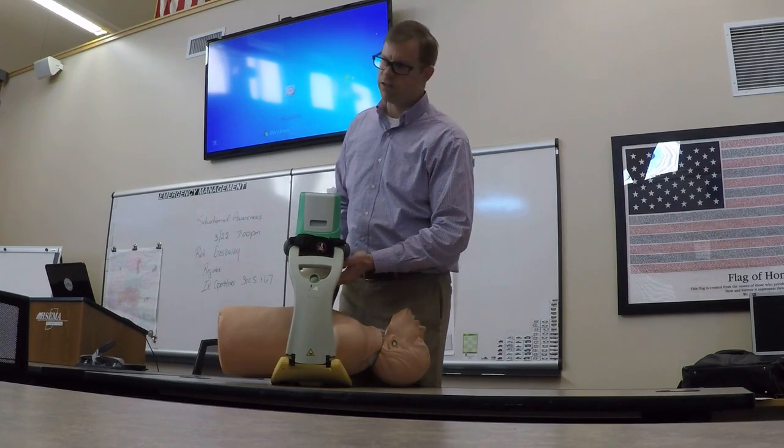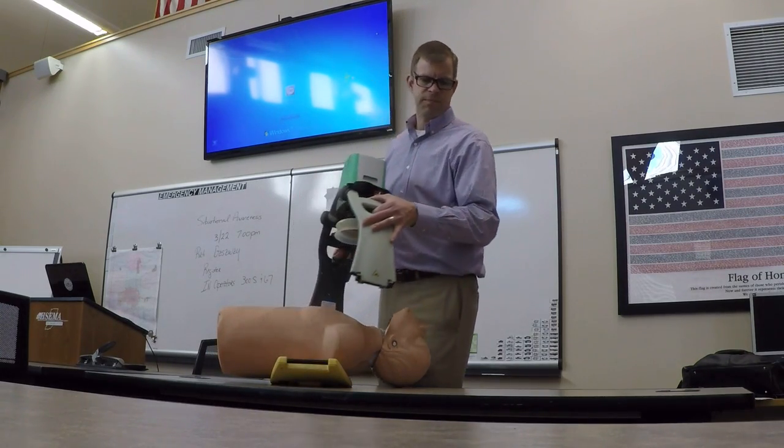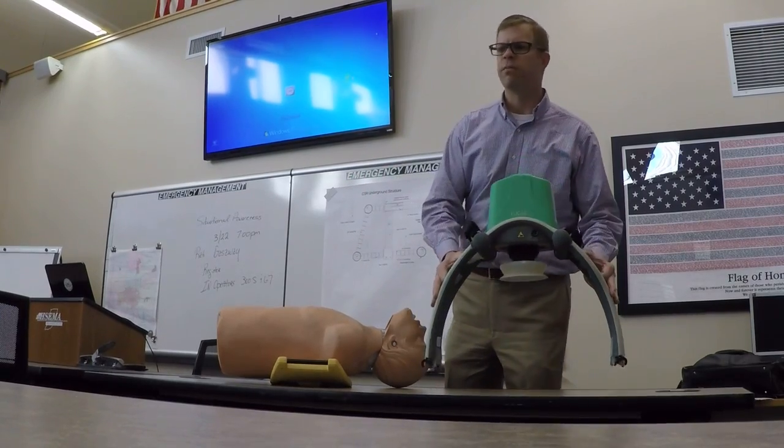The one thing I didn't touch on is the safety side. Obviously, the angle of the back of the device is important.